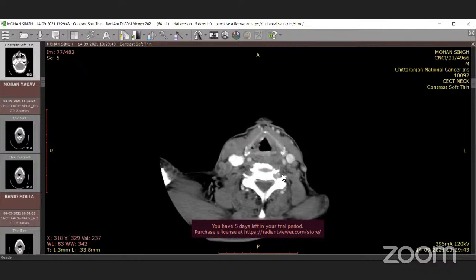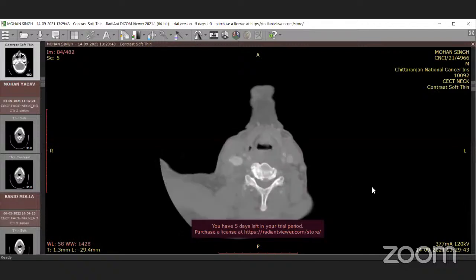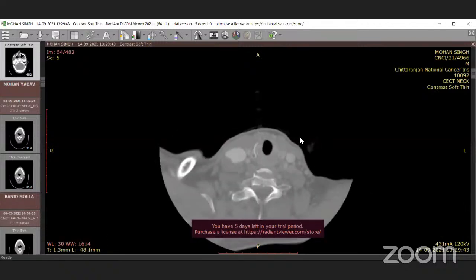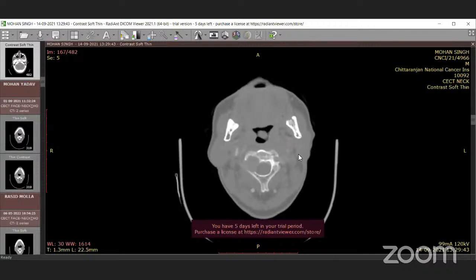Okay. So we are moving to another important thing during any radiological anatomy or contouring. It is required, that is the parts of the vertebral body, especially in the cervical vertebra, as we are dealing with head and neck now. So could you please show us the parts of the vertebral body? Okay, I will take you through a few of them.